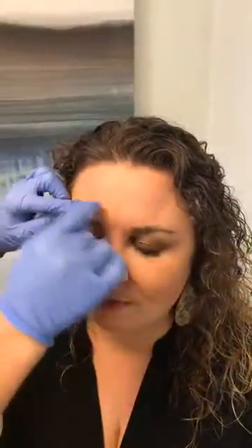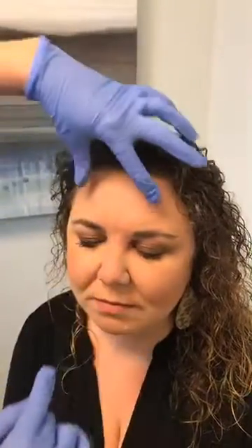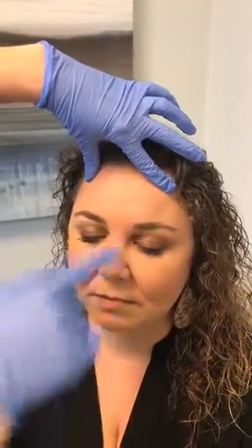And so what happens is I'm weakening these muscles, and then the forehead will lift, and so she'll get a nice eyebrow lift, and she'll look less angry. Just kidding, Kendra. But anyways, when she's teaching school, they won't know she's mad. No, we won't do that to her. She'll still have plenty of movement.